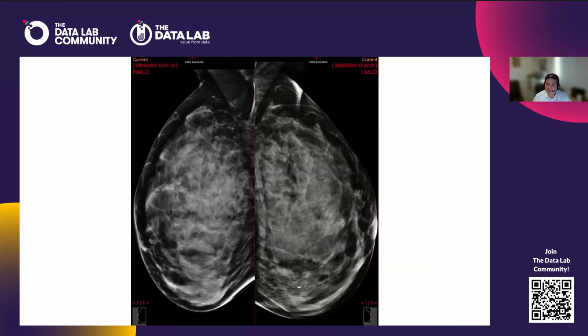This is a left and right sided MLO imaging of the breast. A woman who's about 50 years old. And if we talk about breast density, this is a very dense breast tissue. The white stuff is dense glandular tissue, and the black stuff is fatty tissue. So you can see that there's a lot of the white stuff there. And sometimes cancers can hide among this white stuff that makes it hard to see.